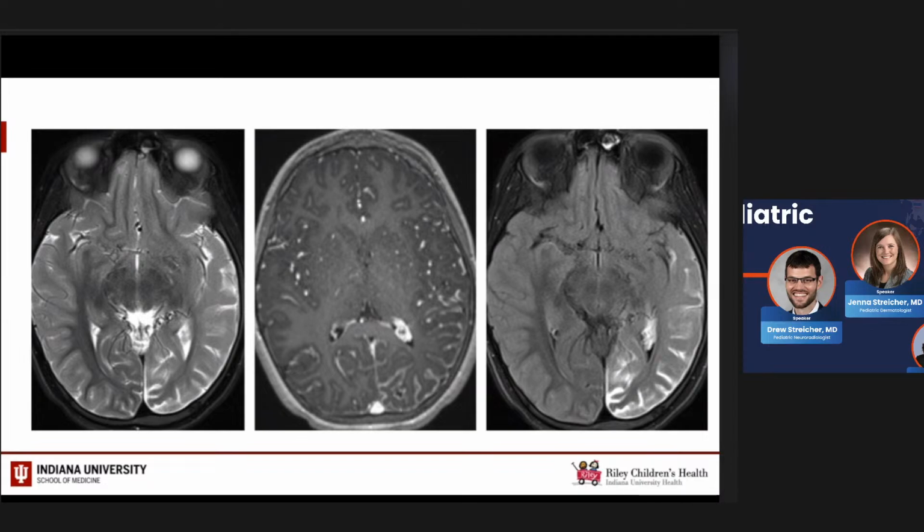So post-contrast FLAIR is your most sensitive sequence that we can run for leptomeningeal disease in general. So with Sturge, as we have the leptomeningeal enhancement from the pial angiomatosis, you have very high sensitivity and really good contrast to detect this. So the post-contrast FLAIR really is a nice sequence when you're looking for those really early subtle cases of Sturge-Weber, that this may be the only sequence that you see an abnormality on. So very great sequence to add on for these cases to increase your sensitivity.